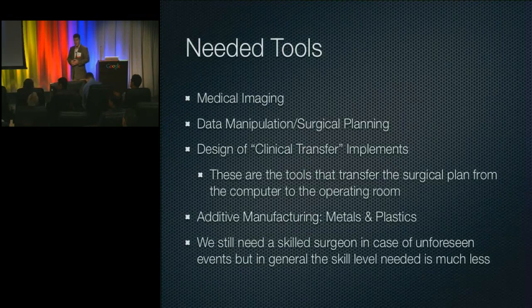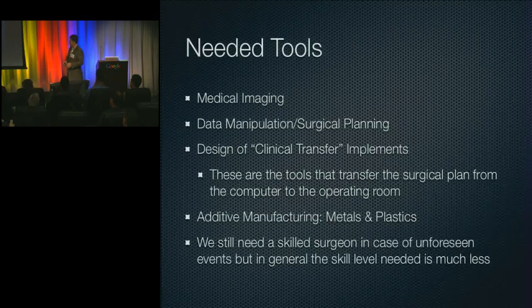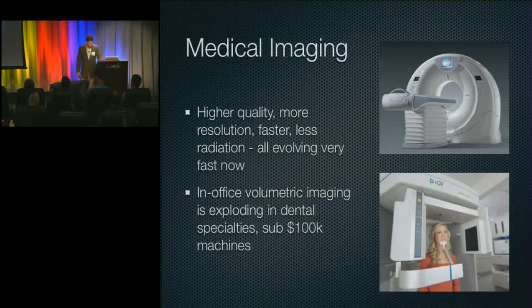This turns out to be where a lot is in how you interact with the data and what you do with it, and how you change that raw data into a plan that a surgeon can use to actually guide surgery. So not just pretty pictures, but really guiding pictures that end up guiding treatment. And then how do you get to that treatment? Where additive manufacturing comes in is what we call clinical transfer. If you've got a surgical plan in the computer, how do you take that and apply it to the surgery, without just taking it in your head and saying, okay, I cut this bone and I moved it around a little bit, but actually having something physical to take to surgery.